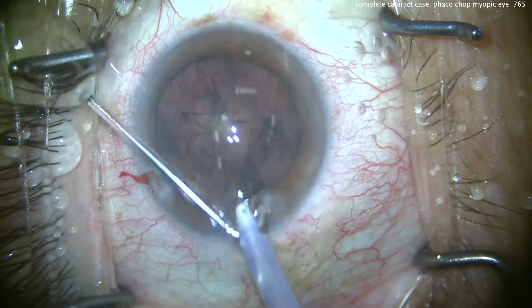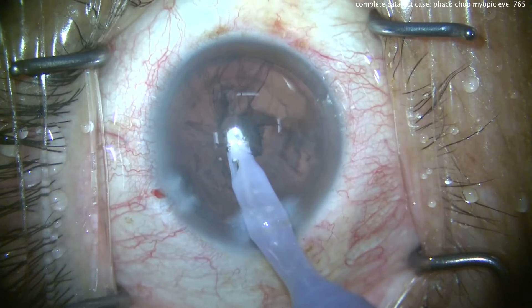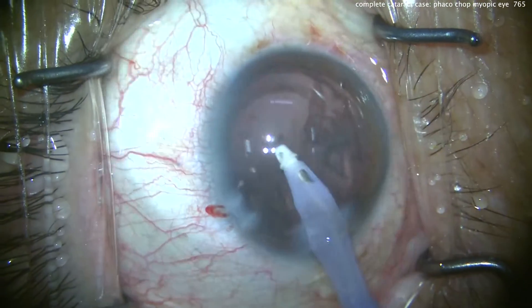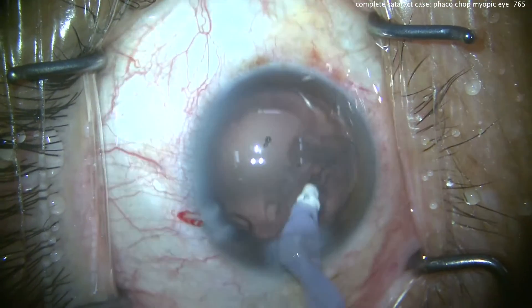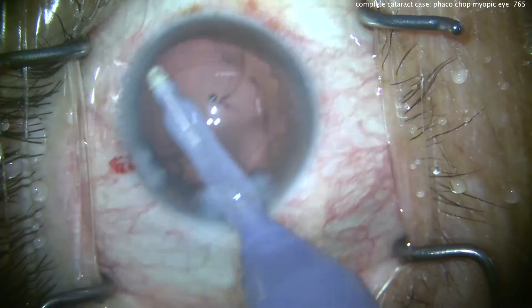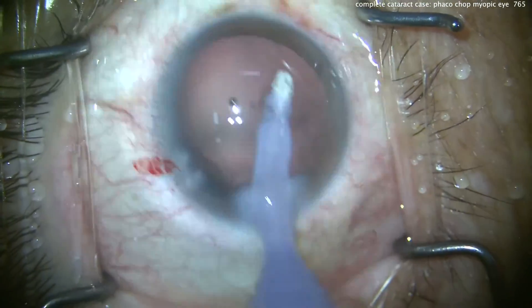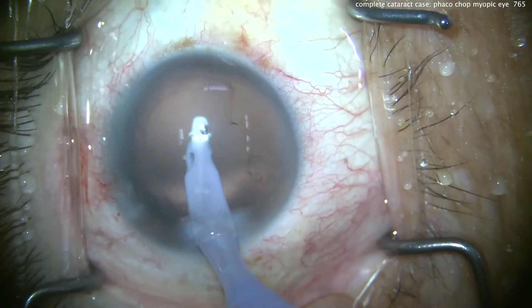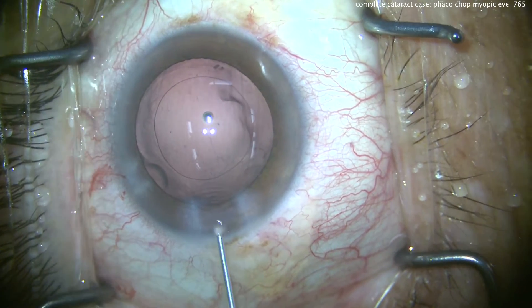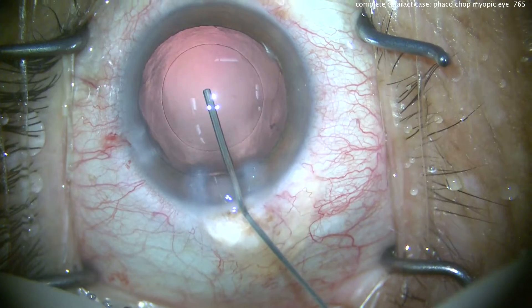Switch over to the IA probe and we'll clean this up quite nicely — cortex removal. Sometimes you will get a reverse pupillary block in these ultra-myopic eyes, and you can fix that by temporarily tenting up the iris. In this case we haven't really had much issue. Cleaning up the capsular bag with a little capsular polishing on the undersurface of that anterior capsular rim. It's a lot easier to work within a myopic eye, which is very large, compared to a hyperopic eye which is very tiny. So we had a lot of easy access to the whole nucleus.